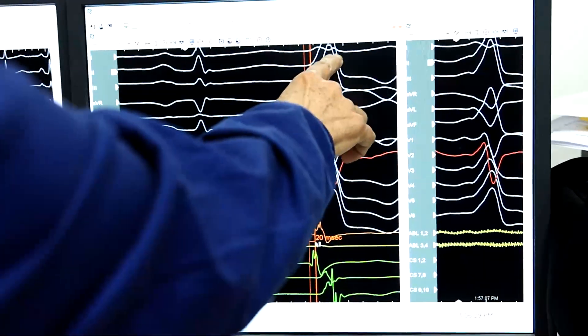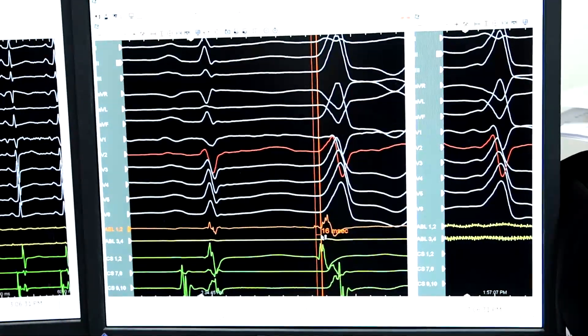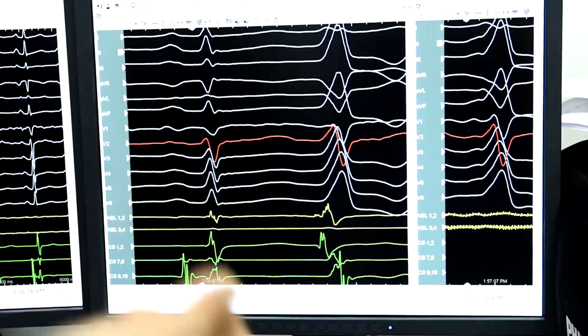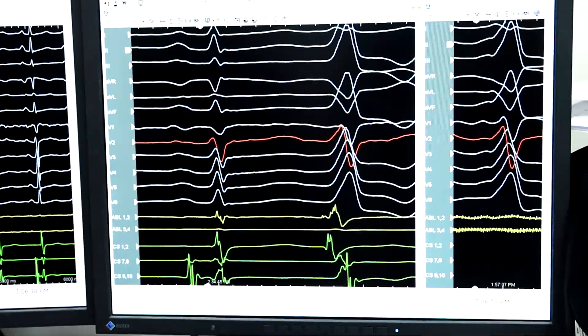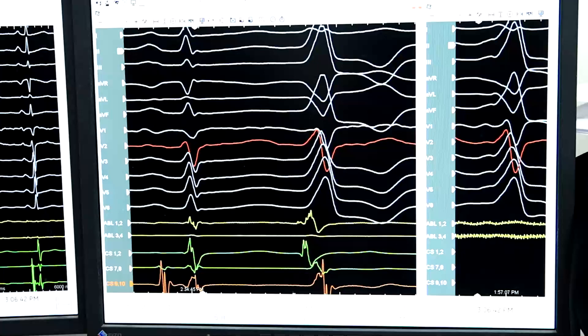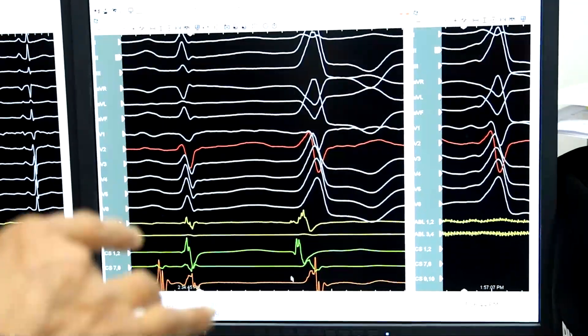I want to show you here that when you hook the ECG electrodes of the limb leads, limb lead one changes because it is not the peripheral arms. So don't depend on this here. We depend on the 12-lead surface ECG.